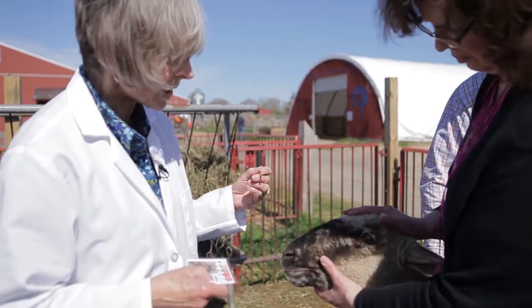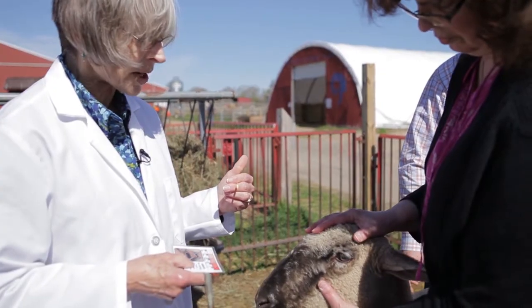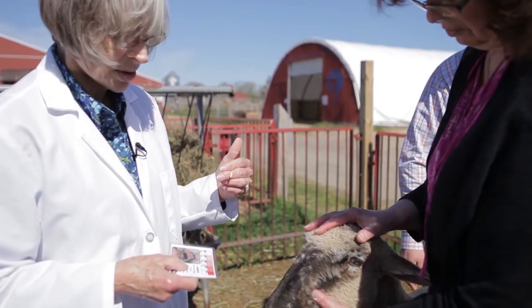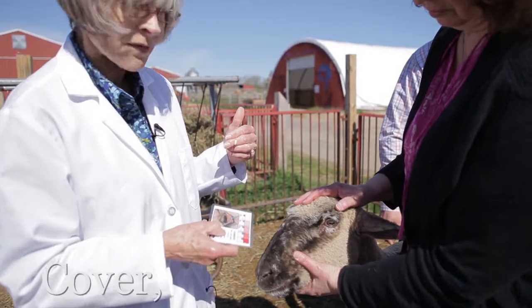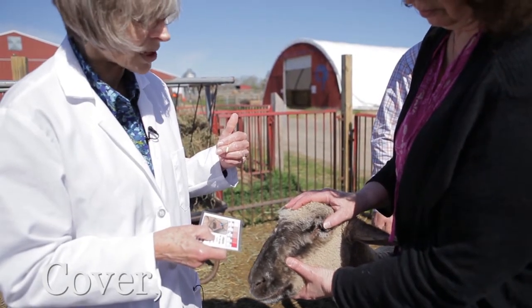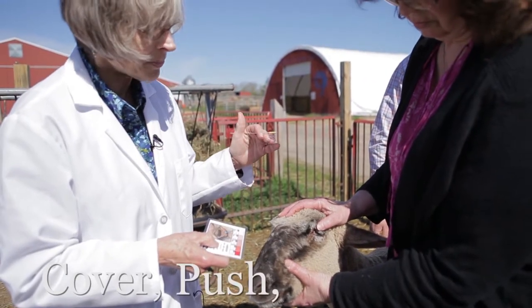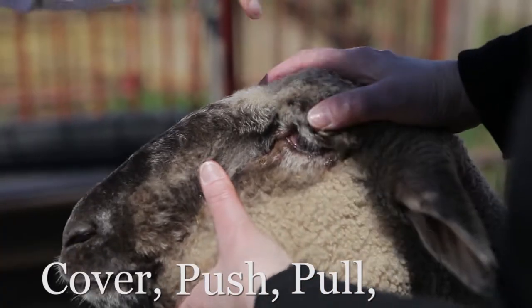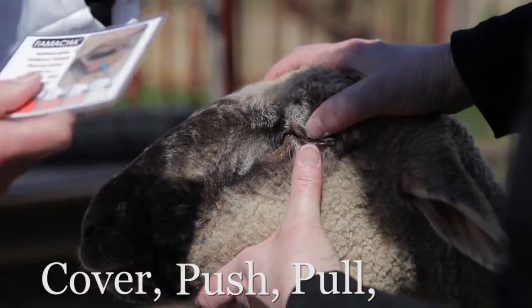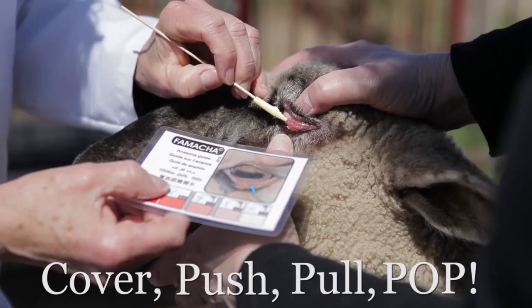Catherine is going to demonstrate the procedure for exposing the mucous membranes so that you can match them to the card. The first step is to cover the eye with the skin of the upper eyelid so you can't even see the eyeball. Then push down on the eyeball, pull down on the lower eyelid, and you'll see those mucous membranes pop into view.